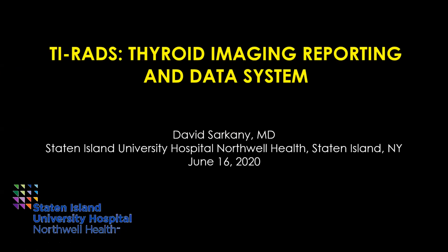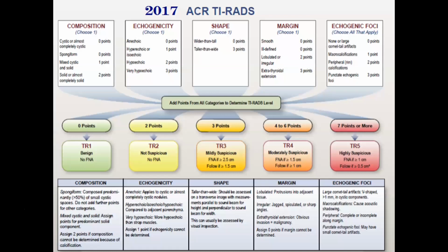Today, I'm going to be talking about TI-RADS, which is the thyroid reporting system. And this is really what should be your Bible every time you read a thyroid scan. In 2017, ACR came up with this grading system, which has been extremely helpful. Thyroid nodules have always been very difficult for most radiologists to give accurate information on, yet it's one of the easiest modalities for the referring physicians to ask us to review thyroid lesions.